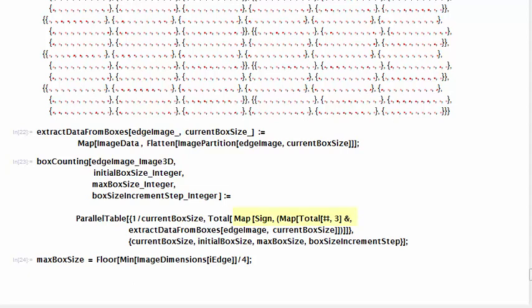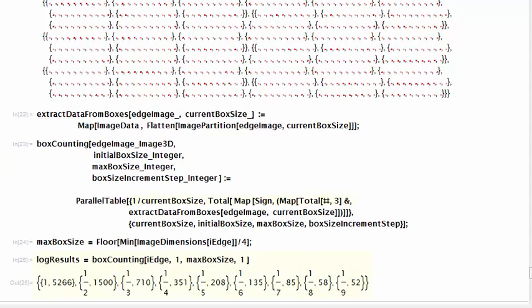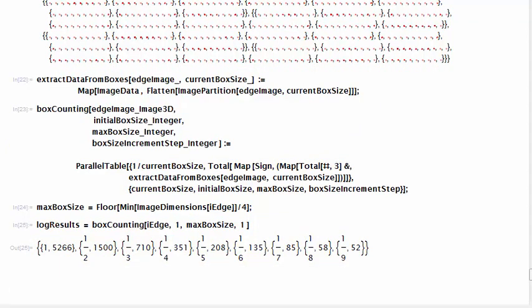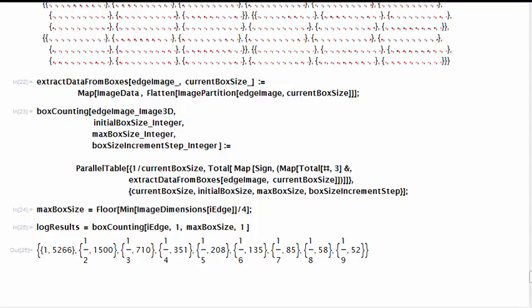We map the function sign to the result from extract data from boxes in order to convert to one all the non-null boxes. We then apply total to add these boxes. We can see that the result of parallel table is a doublet with this total and one divided by the box size using the current iteration. This division is done to create the log log plot to estimate the fractal dimension later.